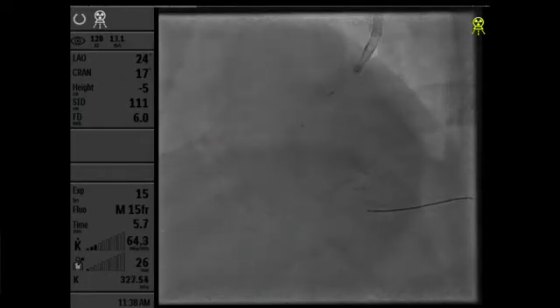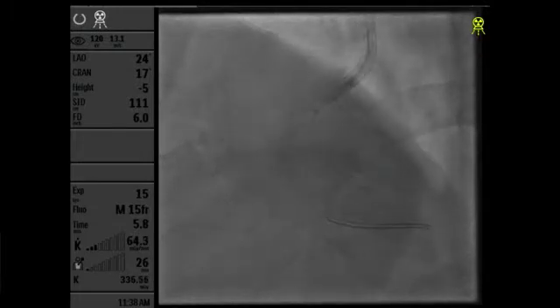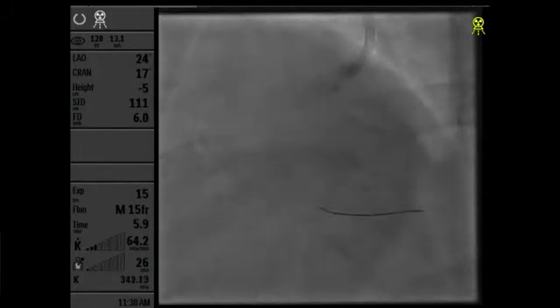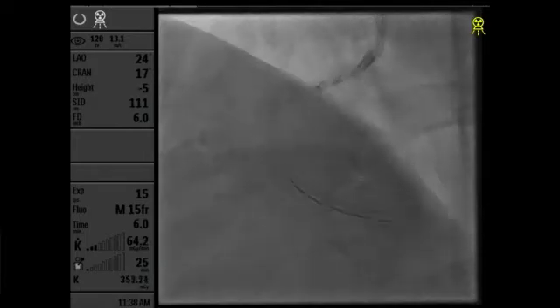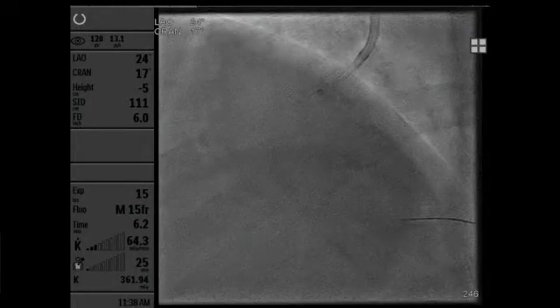I appreciate that question. I'm going to bounce back to Rich Slotmitz, because Richie, you're looking at the OCT from CAD 1 through 4. We have an MOA paper that'll be out online in the next 10 days in JACC CI on the principles of IVL, and I think you'll find it very fascinating. We have just returned to JACC CI with revision 628 patients in the clinical outcomes. This will be an abstract presented at ACC. It's the combined patient-level data, all adjudicated by core labs, and about 18% have nodules on OCT.